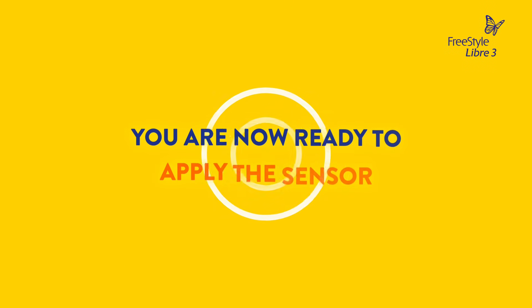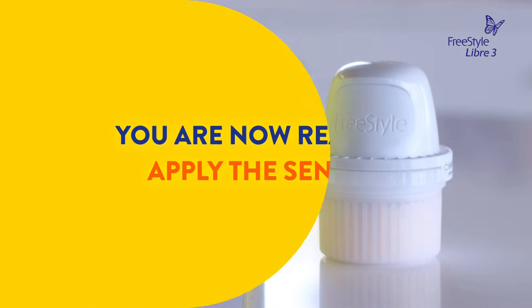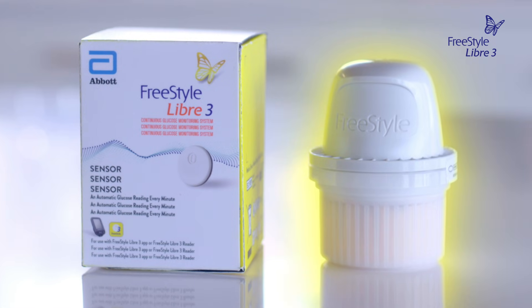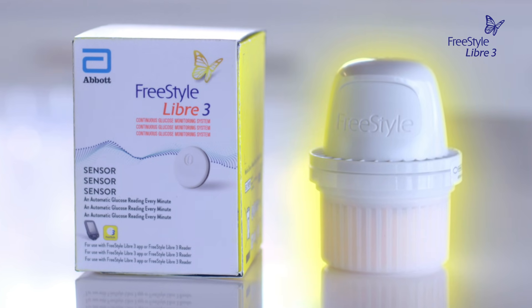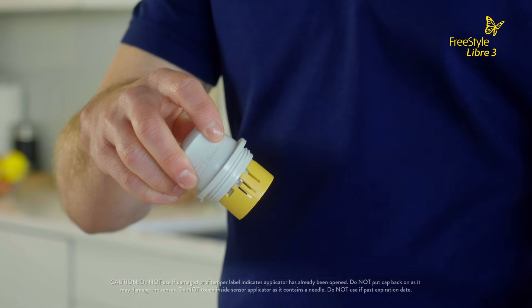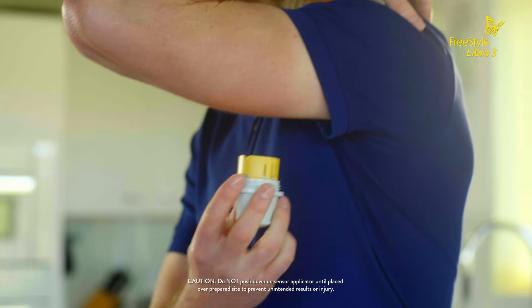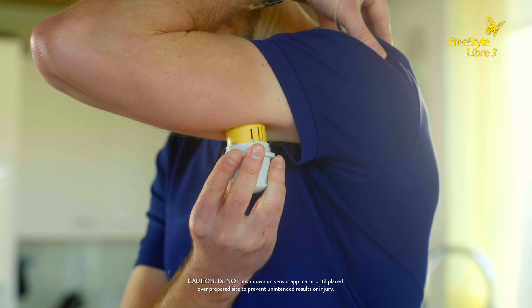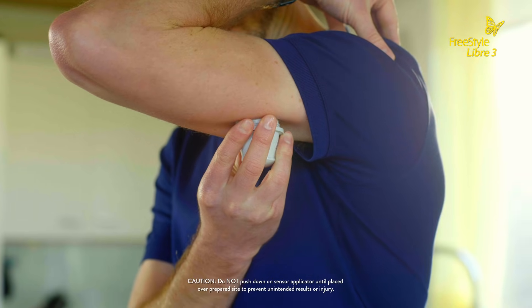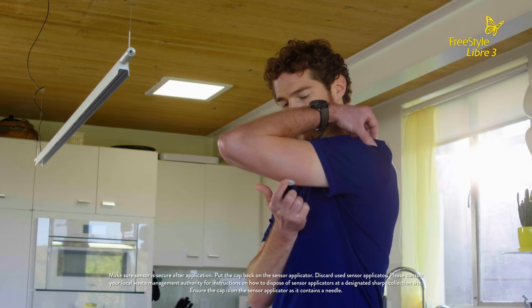After you have finished preparing the back of your upper arm, you are ready to apply the sensor. The Freestyle Libre 3 sensor and applicator already come assembled for you. Simply unscrew the cap and set it aside. Do not put the cap back on as it may damage the sensor. Place the sensor applicator over the prepared site on the back of your arm and push down firmly to apply the sensor to your body. The sensor should now be attached to your skin.